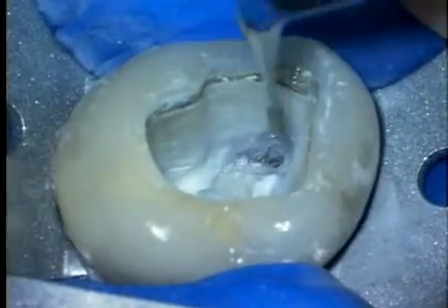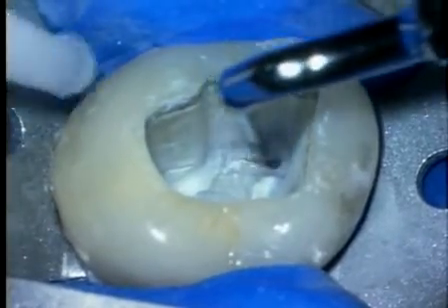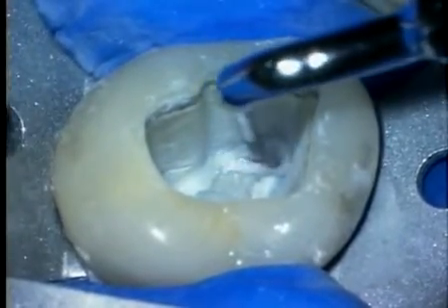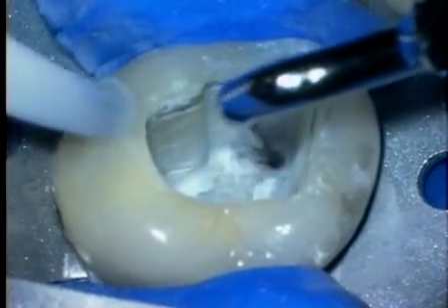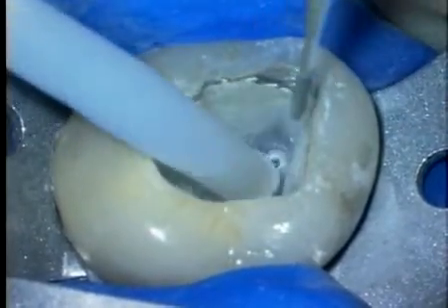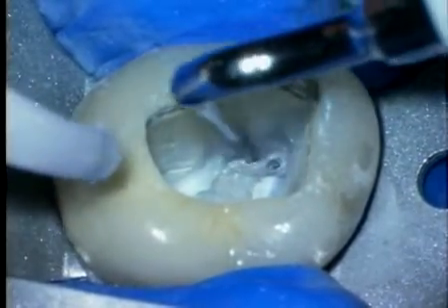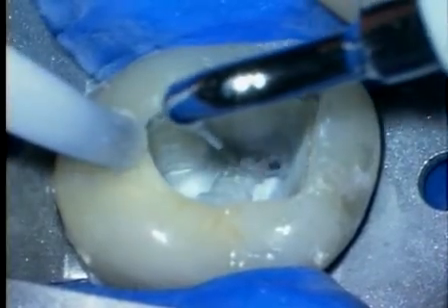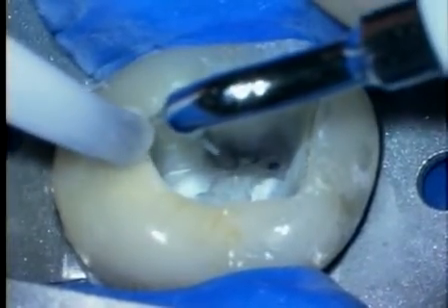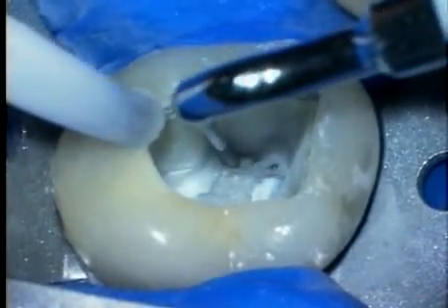Ultrasonics is an excellent way to remove precise amounts of dentin. The entry angle of the MB2 into the pulp chamber is very acute. By removing tooth structure at the junction of the axial wall and the pulp chamber floor, this will give us a better straight line approach into the MB2 system. Again, sand, carrying the ultrasonic instrument in a brush-like motion to remove selective amounts of dentin.